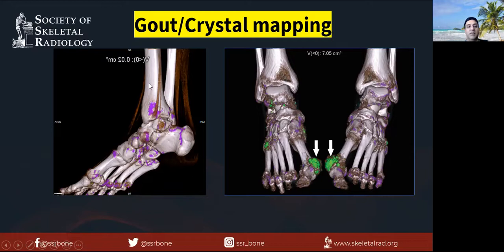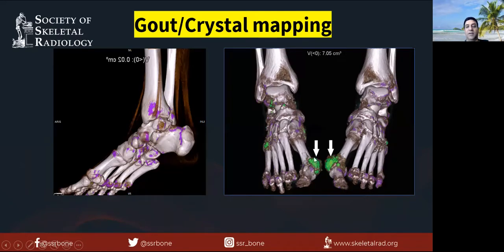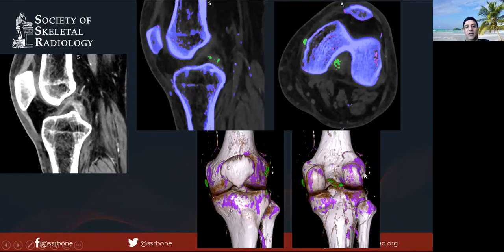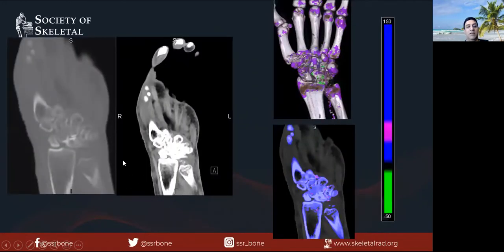You can also do crystal mapping. Normal bones and tendons show a value of zero, whereas gouty tophi appear green. Nail polish and tattoos can also appear green since this is density-based, but if the deposits are periarticular, punctate, or confluent around tendons and joints with a lower uric acid level, you know it's gout. This is now essentially the new standard. You can also quantify the volume — for example, 7 cubic centimeters of gouty tophi. These tophi appear dense on CT and are hard to differentiate from calcium, occurring in pericruciate areas, under the popliteus tendon, or at the UCL. You can also have mixed crystal disease, such as chondrocalcinosis of the TFCC combined with gouty tophi in the dorsal wrist.